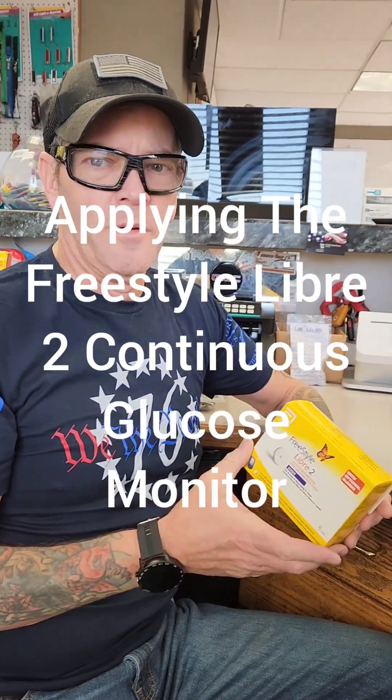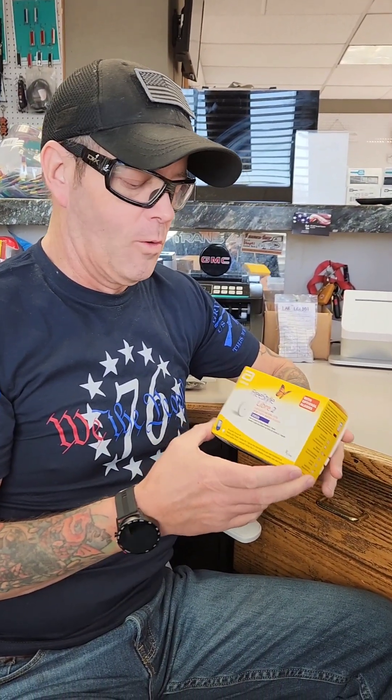Hey guys, I am Glenn with Mr. Crafty Man and what I'm going to be doing today is show you how to install, for lack of a better word, a Freestyle Libre 2.